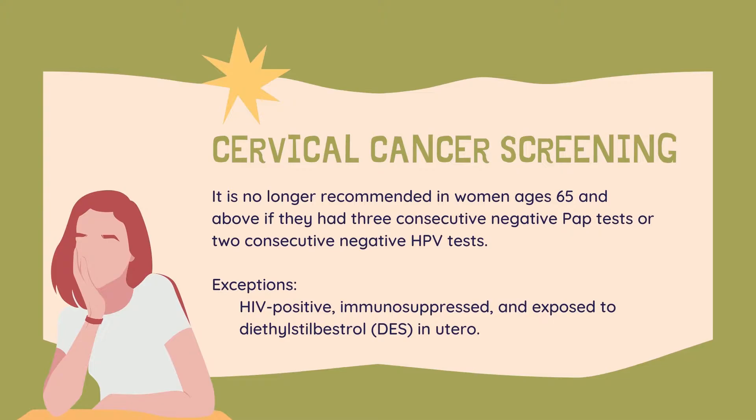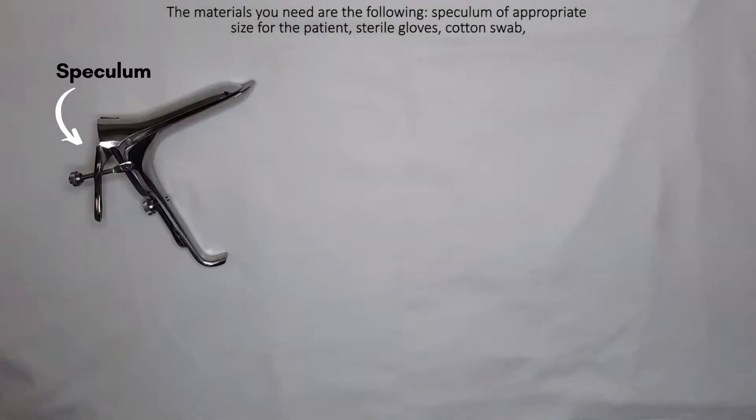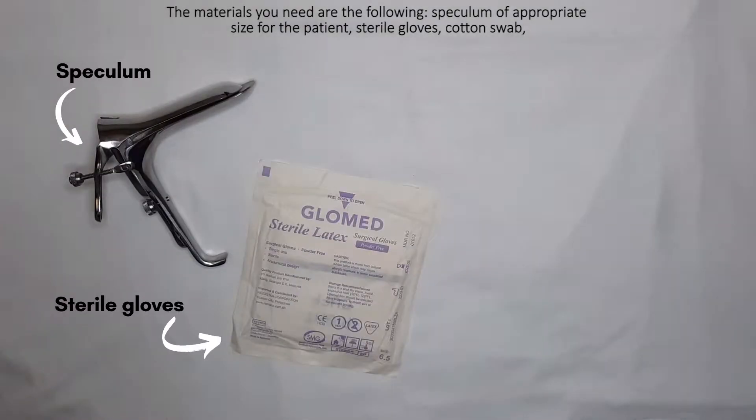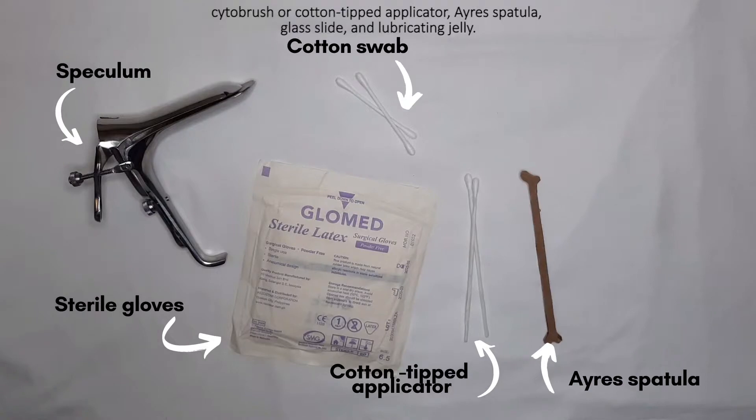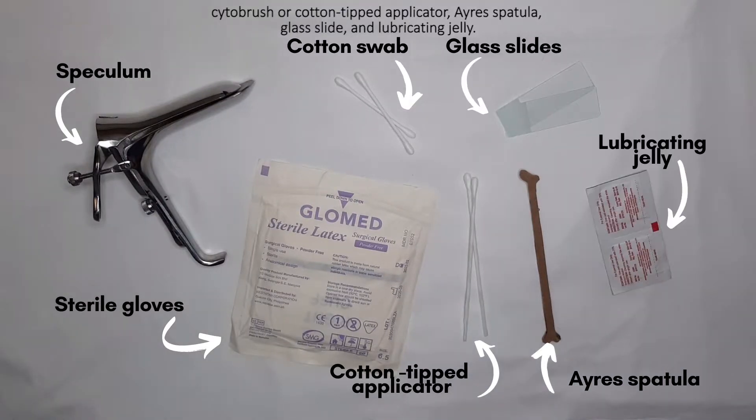Exceptions are those who are HIV positive, immunosuppressed, and exposed to diethylstilbestrol in utero. The materials you need are the following: speculum of appropriate size for the patient, sterile gloves, cotton swab, cytobrush or cotton-tipped applicator, Ayre's spatula, glass slide, and lubricating jelly.